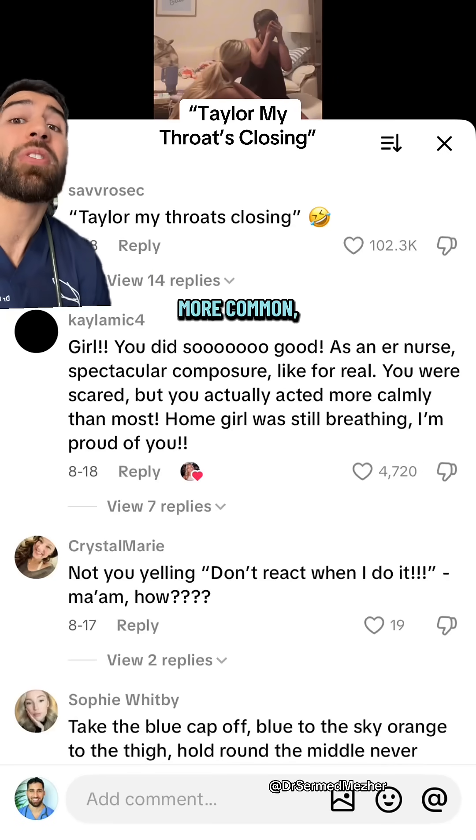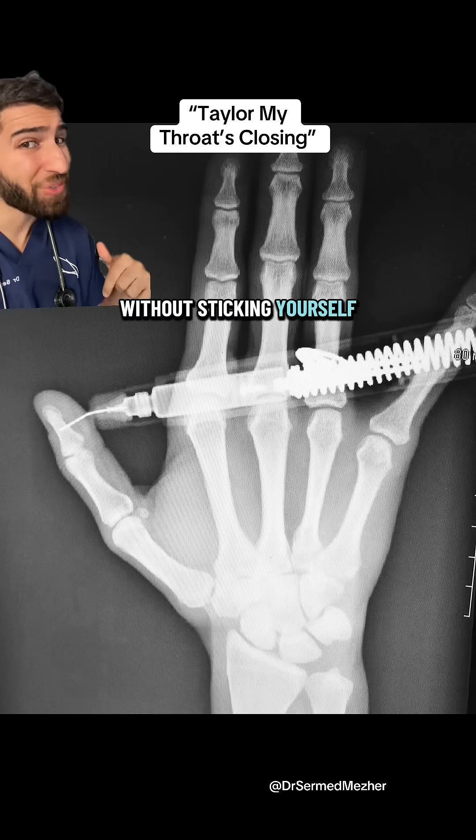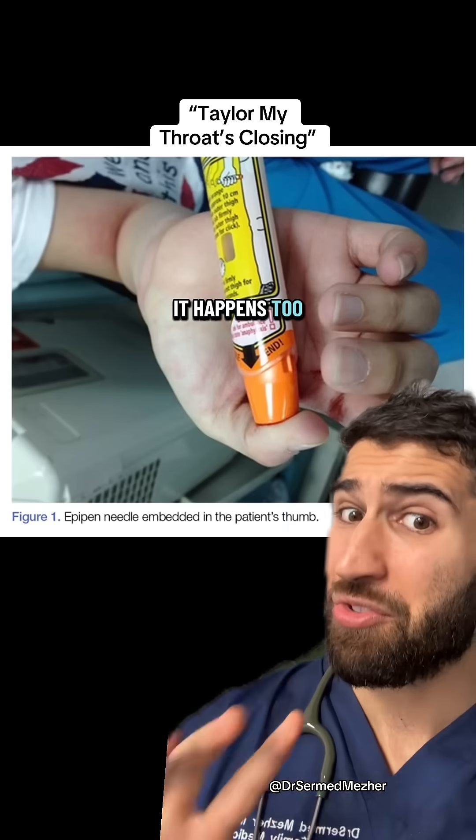Severe allergy is getting more and more common. You never know when you'll need to give an EpiPen, so how do you do it without sticking yourself in the thumb? It happens too often.